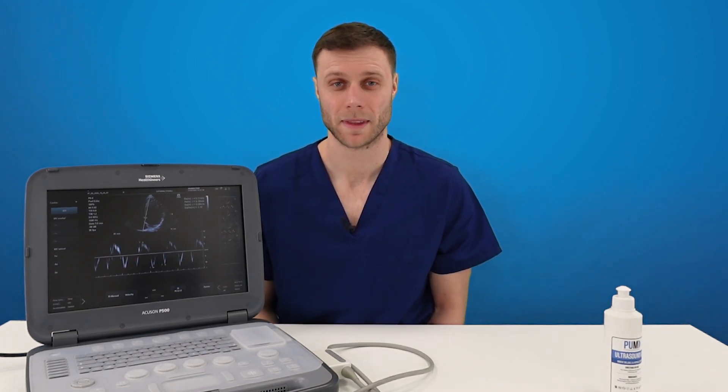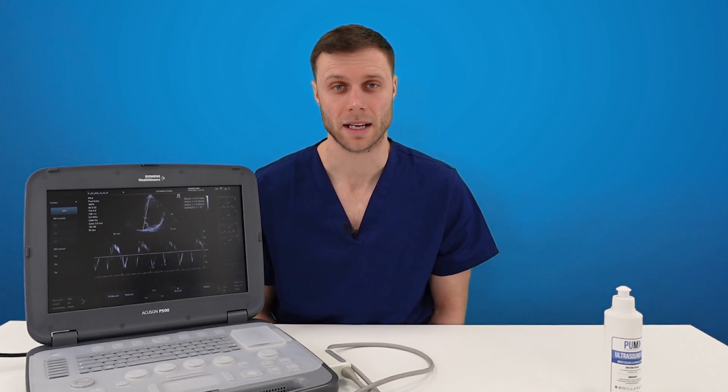Hello and welcome to this video. In this video we're going to show you how to measure TDI, tissue Doppler imaging.